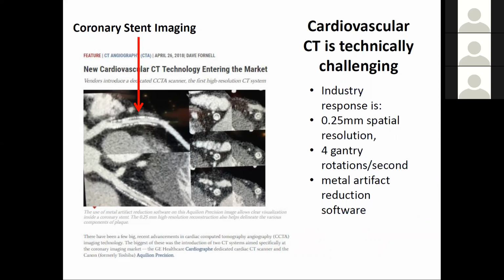So you get a combination of two. The being different from water is metal artifact per se, but a lot of times what gets called metal artifact will be starvation in the presence of metal. And starvation just means that the value you measured along that CT line of response is comparable to electronic noise or zero. That's what you're taking the logarithm of, and it just got unreliable. Let's say you've got 1 million photons per line of response per integration interval as you're sweeping around. If there's 1 million of them, and then you have a 10 to the 6 attenuation on a particular line of response, you just got one, and you can't see one X-ray reliably compared to electronic noise.